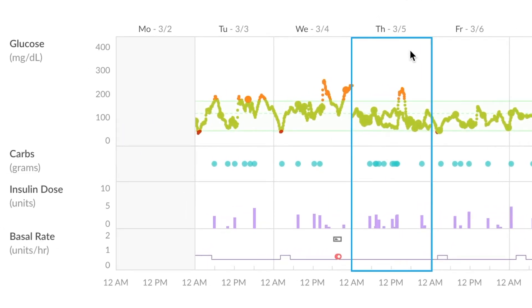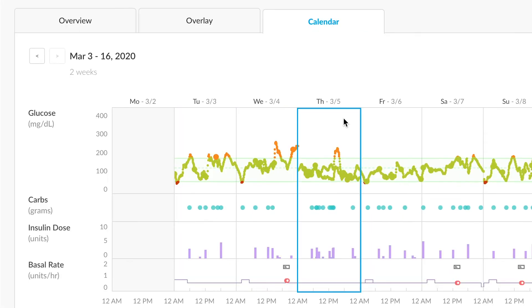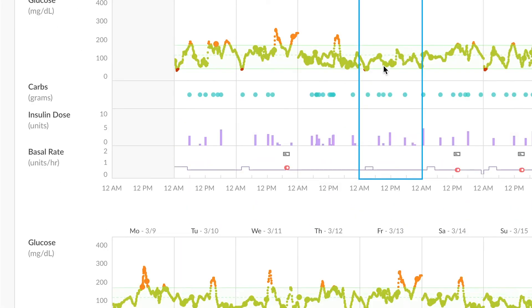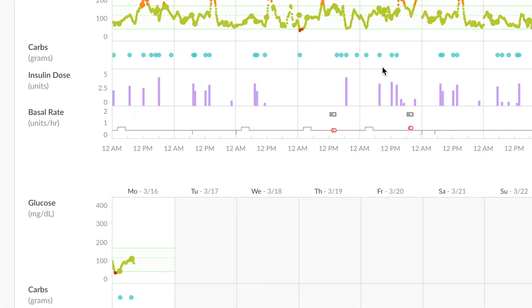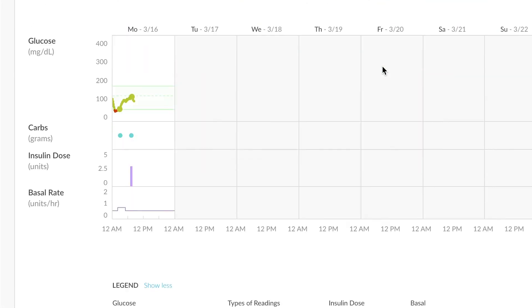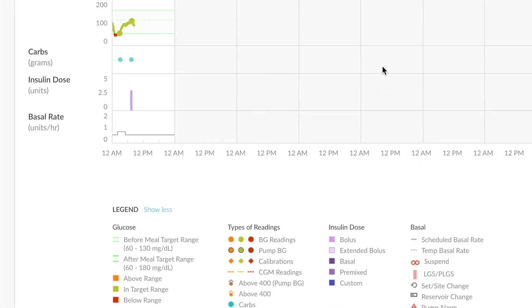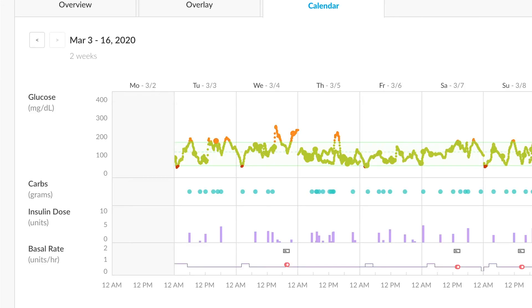Glucose, carbs, bolus, and basal rate display in stack graphs that allow for comparison of various data points. Once again, there is a very helpful legend at the bottom that can help you out. Clicking on any one section in the calendar view will actually take you to an overview of that day.